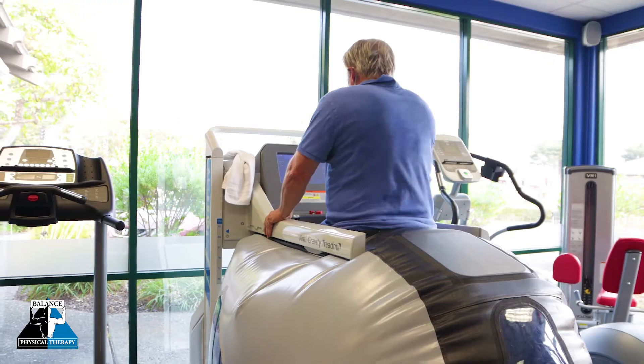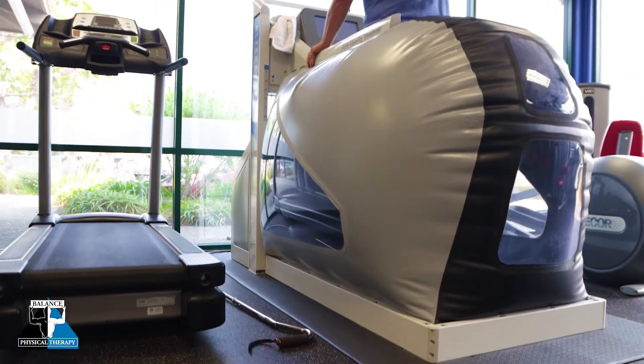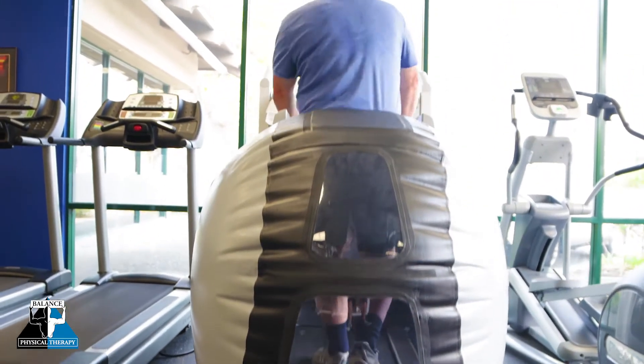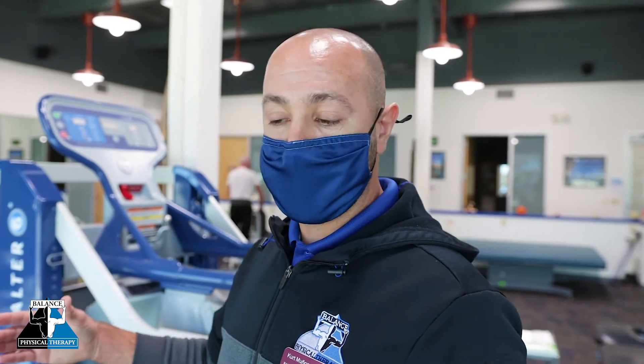We can use it in preparation for a surgery. For example, if someone is coming in and preparing for a knee replacement and they can't put as much weight on their knee and have a normal gait cycle as they otherwise would, we can take some of their body weight off and help them with their gait progression leading up to surgery to help them maximize their recovery afterwards.